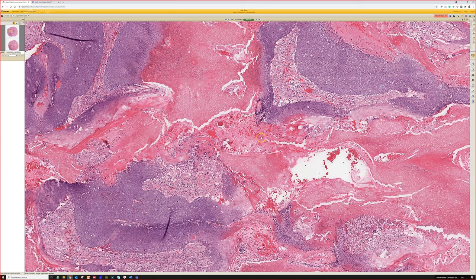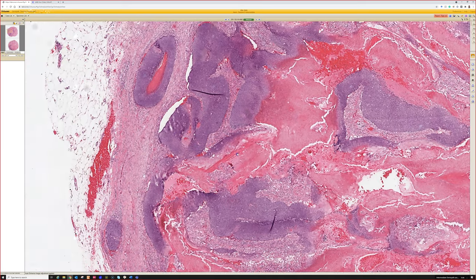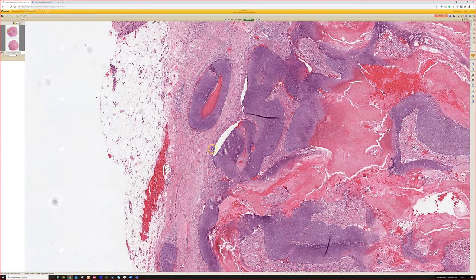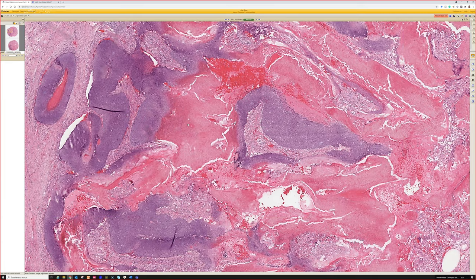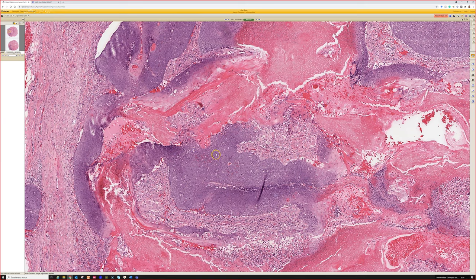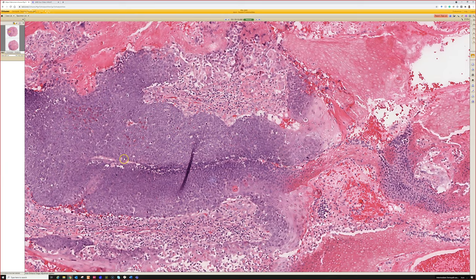So most of the time if I look at something and I think this looks like a pilomatrichoma, almost always it ends up being a benign pilomatrichoma. I have seen one exception I can think of that was a massive tumor that grew really rapidly and looked just like pilomatrichoma up close, but it had islands of tumor growing way out into the soft tissue away from the main mass and was clearly behaving in a malignant manner clinically. So that I would say is a very rare exception. Normally once you say pilomatrichoma, it's almost always going to end up being benign. That's just been my experience.